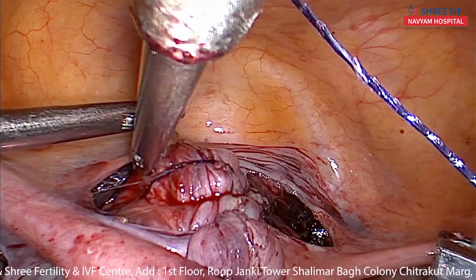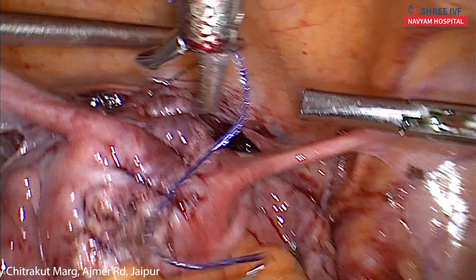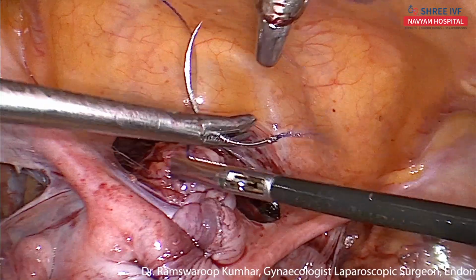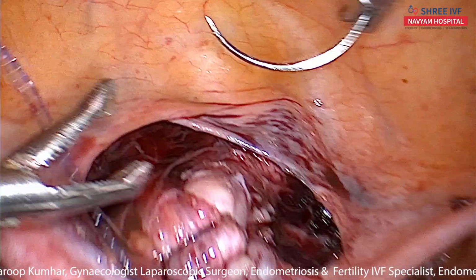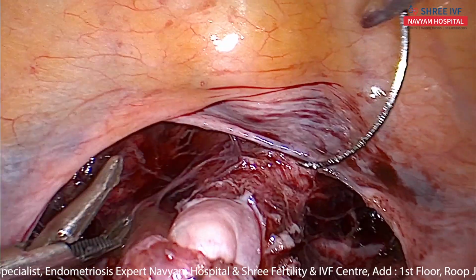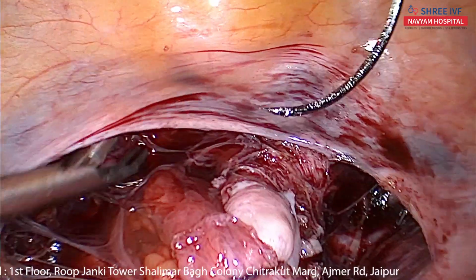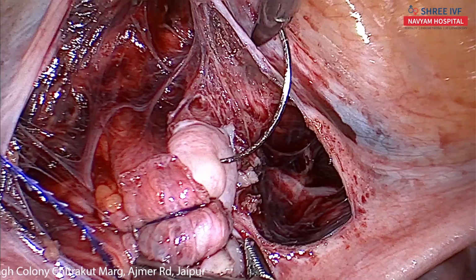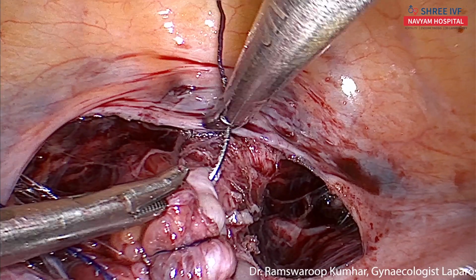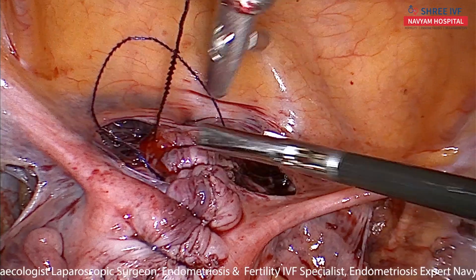I'm trying to obliterate the dead space completely. This one more stitch is needed here. Pull your side. Pull your side like this. And this is the last bite.